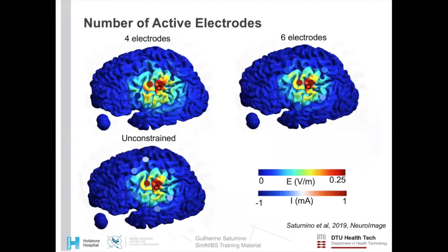One factor which we found not to be particularly important to obtain focal electric fields is the number of active electrodes. In this example, there are three optimization results with four, six and an unconstrained amount of active electrodes. We see some small gains in focality in going from four to six electrodes, for example, eliminating this side maximum over here. However, the difference between six and unconstrained, possibly over 60 electrodes, is very small.